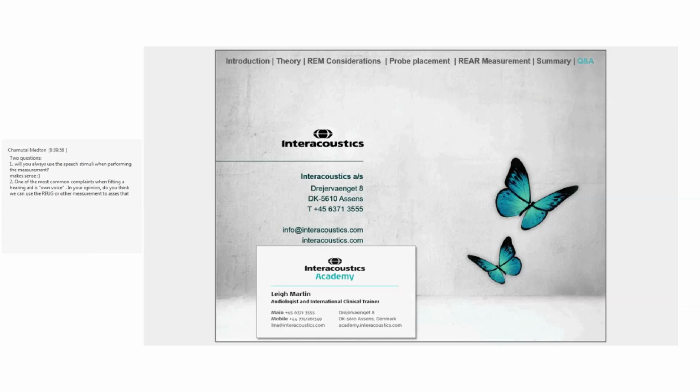And I believe there were two questions. Okay. So one of the most common complaints when fitting a hearing aid is its own voice. In my opinion, do we think we can use the real ear unaided gain or other measures to assess that?